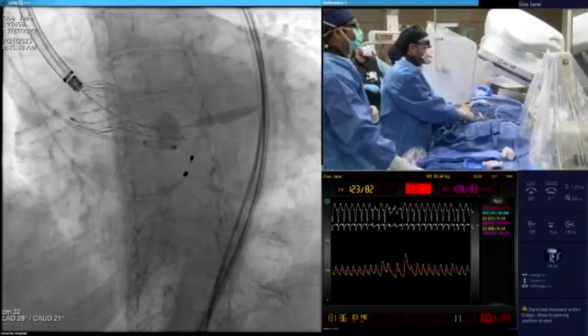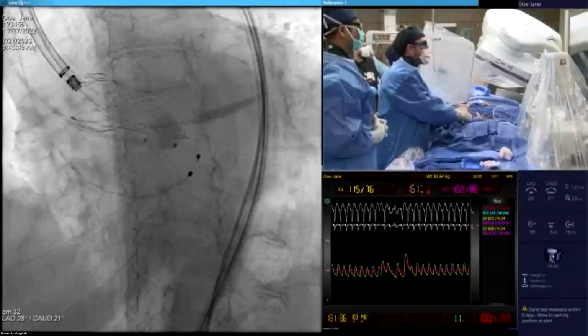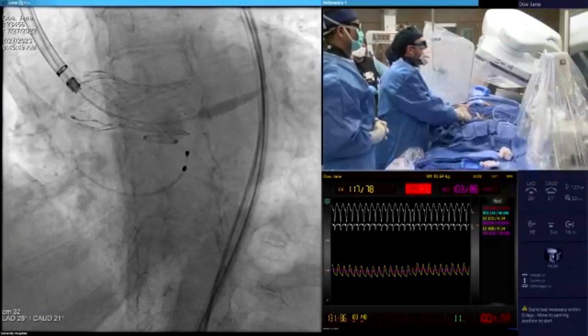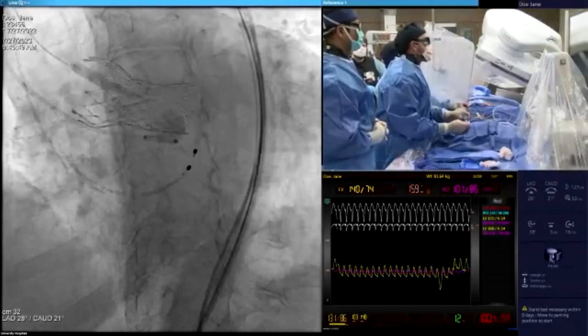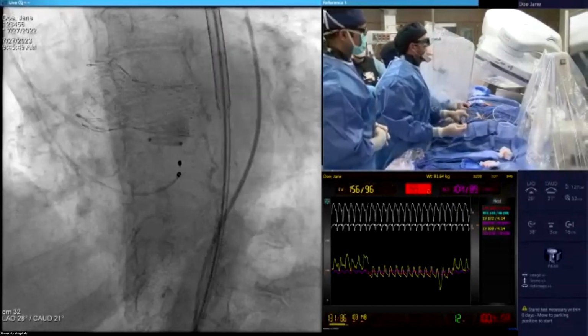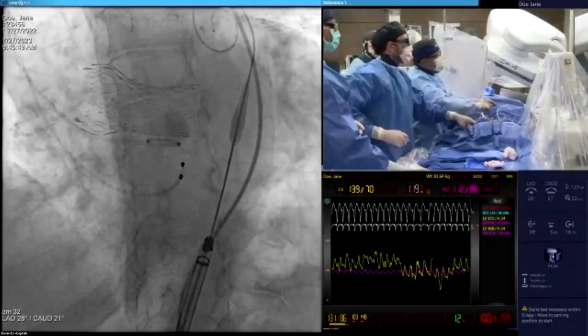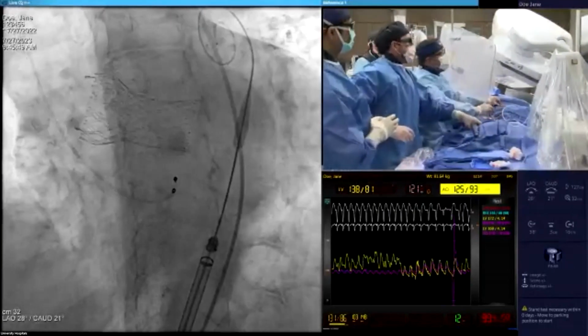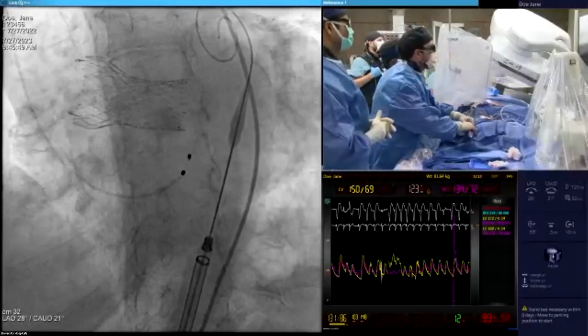See, one of the hooks is out, we're still connected to the catheter. I'm coming slow to finalize the disconnection, which happened right now. We don't keep wiring the ventricle, pacemaker at 120. And we're going to dial down the pacemaker progressively. Good. All right, excellent. Pacemaker off.